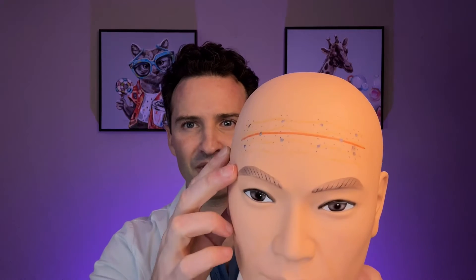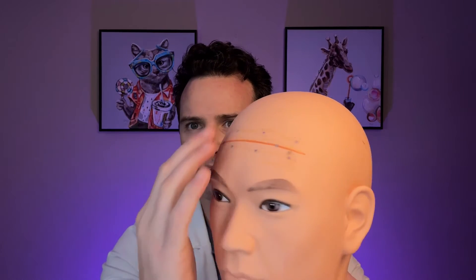The third technique is designed for clients with a lot of muscle activity on the frontalis who also have enough surface area. I want even distribution, so I increase my injection points. This is my ten-point technique — let's bring in Stuart. We have the line of convergence marked where his forehead starts bending back. I place two injection points above it, two just below it, and one right in the middle on each side. This is perfect for a masculine client you want to keep with straight eyebrows. For a feminine client, you can remove the lowest point or move it onto the C-line.